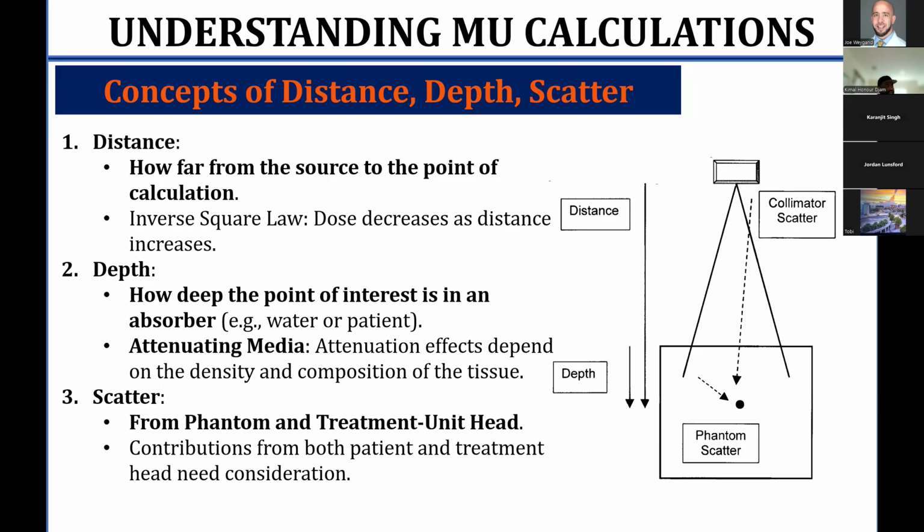Then you have the next factor, scatter radiation, which we've talked about, and which comes from two primary sources: the treatment head unit as well as the patient.